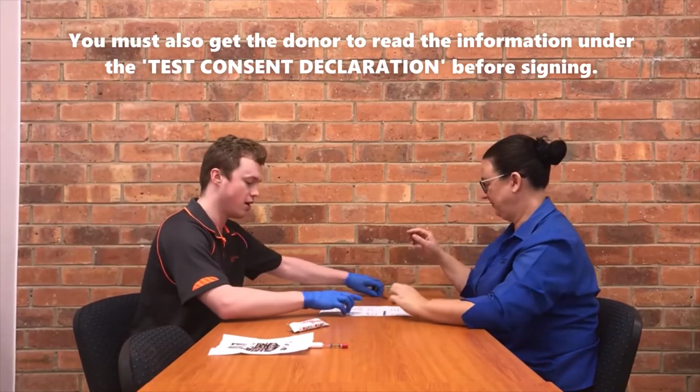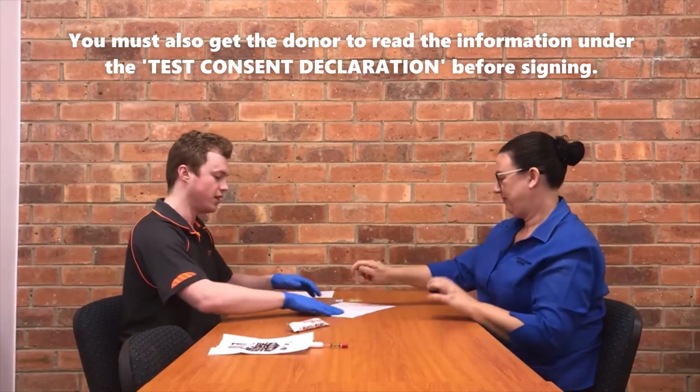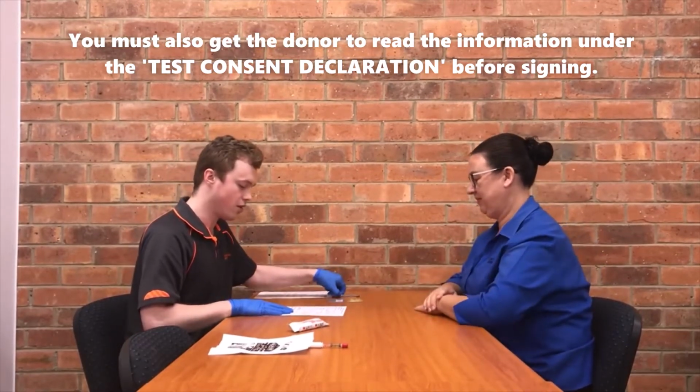Now I did explain the procedure that we're going to do today to Kim. In your video, you'll obviously need to explain it to them, but for the sake of this video, I've already explained how we're going to do it. You'll need to ask for their consent. So Kim, do you consent to being tested today? Yes. Perfect. Just get them to sign. Perfect. Thank you. Wonderful. All good.